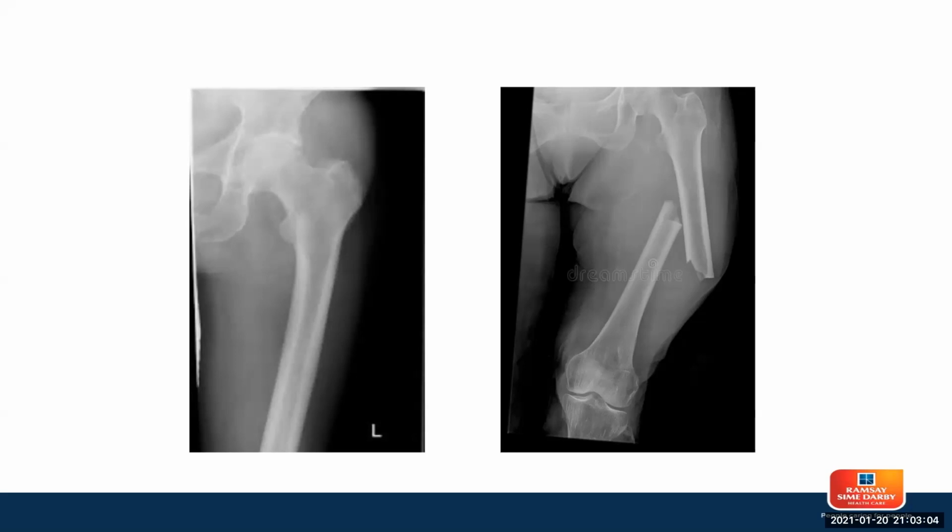Okay, so just to make it basic, I think the main aim here is, since I assume most of the participants are junior doctors or those who are just starting off in orthopedics, or even in other specialties where you may have to deal with fractures, the important thing is to know how to present the X-ray to somebody else. It's no point just saying I have a patient with a fracture and not actually explaining it properly. Those who are doing orthopedic postings, if your boss or your MO or your specialist is a little bit more old school, you might end up getting into a lot of trouble if you don't present properly or explain properly what it is you're talking about.